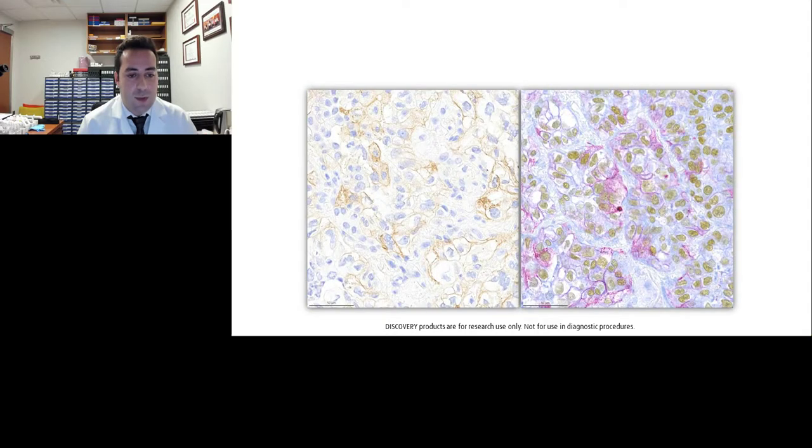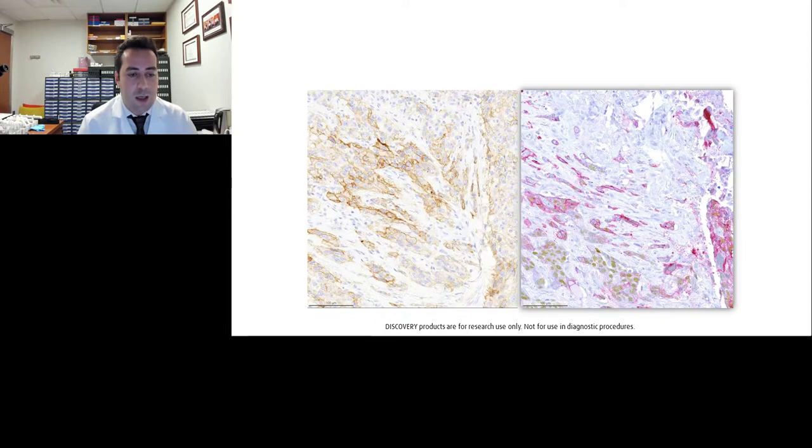And in this sample, it's a case with mild to moderate positivity for PD-L1. And I tried to capture the exact same areas to compare the staining quality. I can say that the variation in staining intensity with the red chromogen is very similar to DAB, and the percentage of positivity is also accurate.